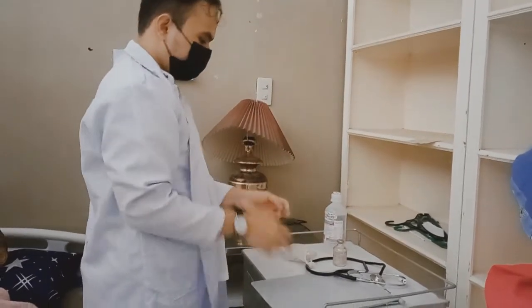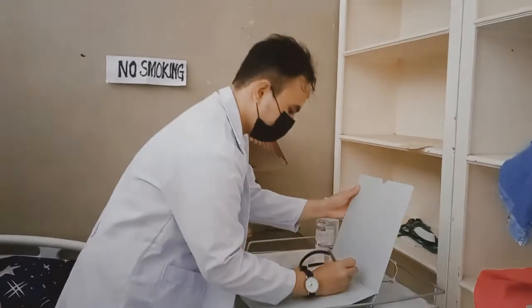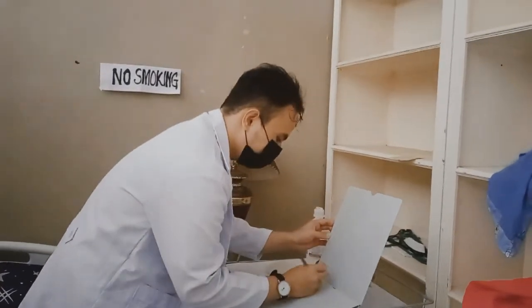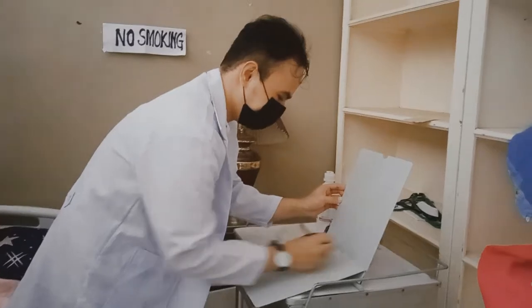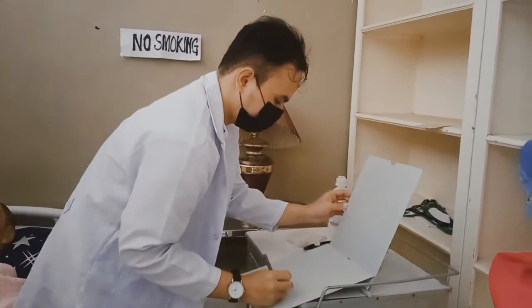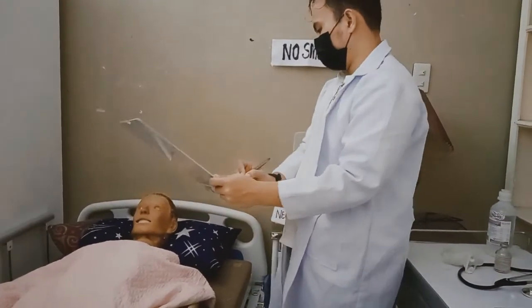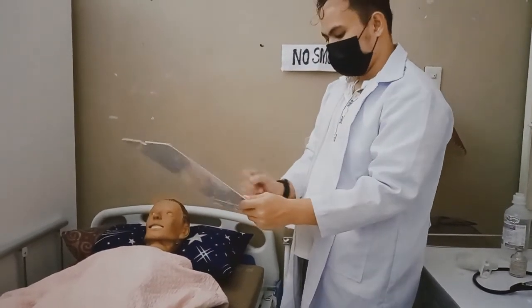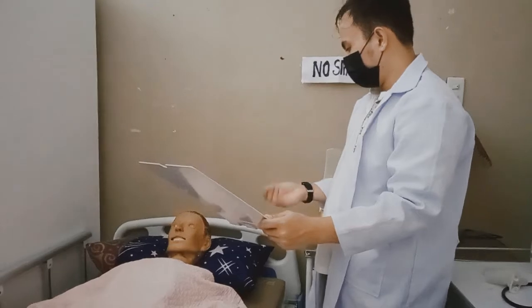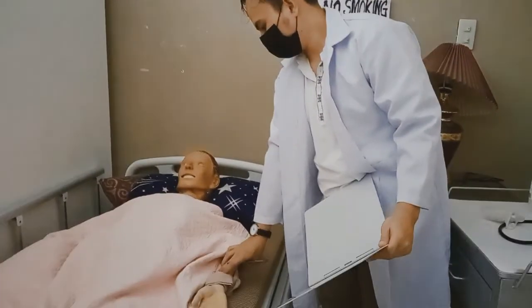Document the administration of the medication immediately after the administration. See the documentation section below. Evaluate the patient's response to the medication within an appropriate time frame. Assess lung sounds, oxygen saturation, and respiration.